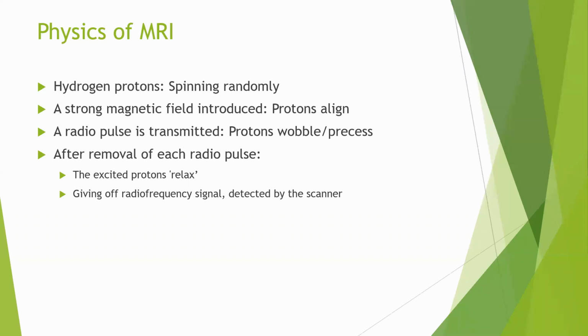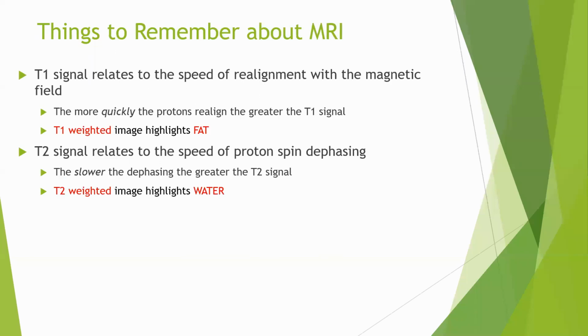Okay, good. Now, things to remember. Before I go on to this slide, if you are starting to read MRI, let's say a patient comes in with an MRI and honestly you don't know what to do. After going over this webinar and when you reread the content, don't jump in and see the report. Never see the report when you are starting to evaluate an MRI. Whatever you see in the MRI, write it down on a piece of paper, maybe 3 or 4 points. Compare and contrast the report of the MRI with what you have written.